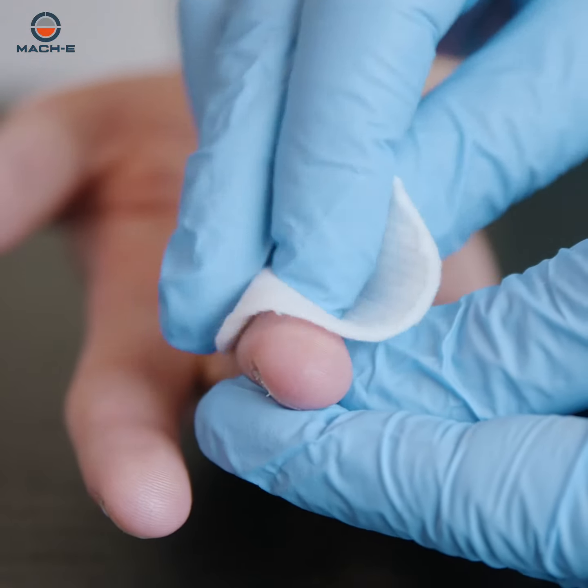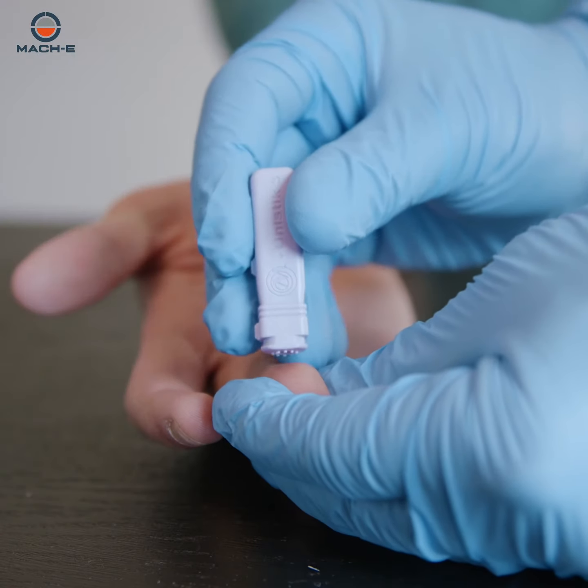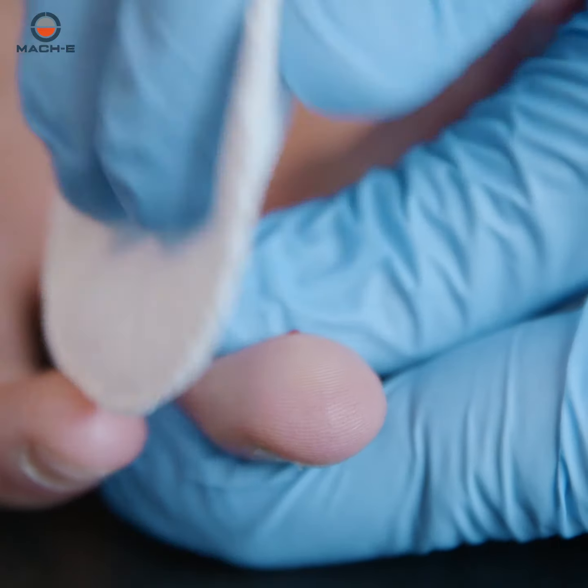Clean the hand of the patient with alcohol and allow it to dry. Puncture the fingertip firmly with the sterile lancet and clean the first sample of blood.